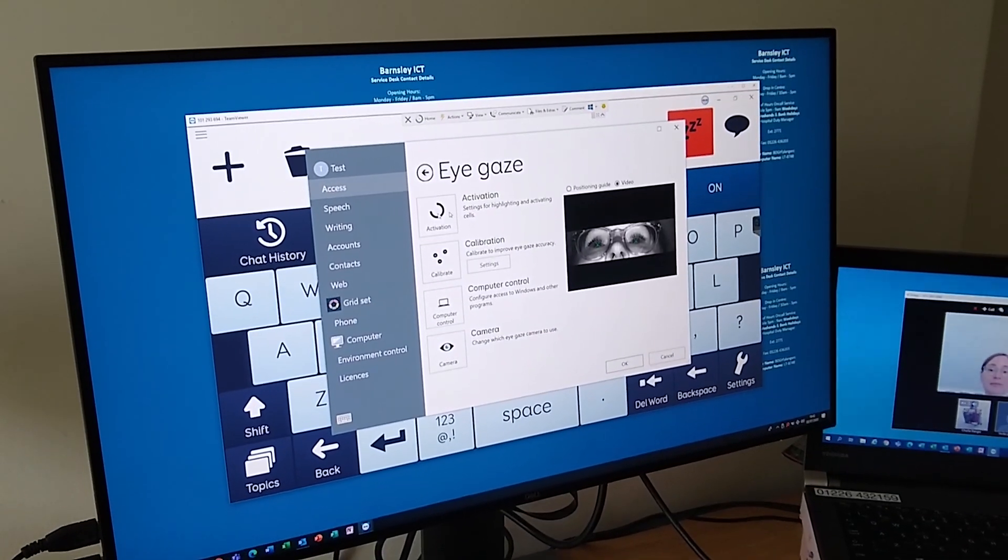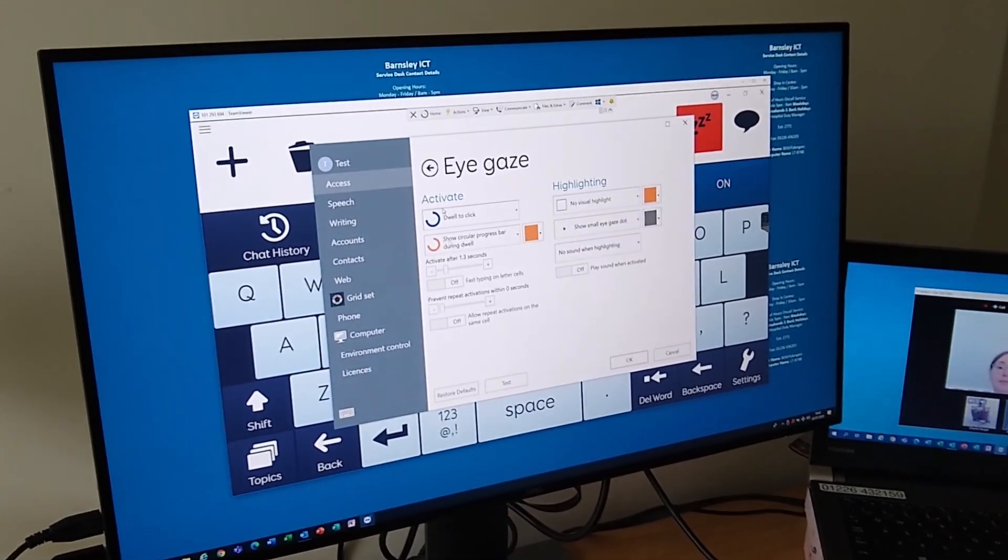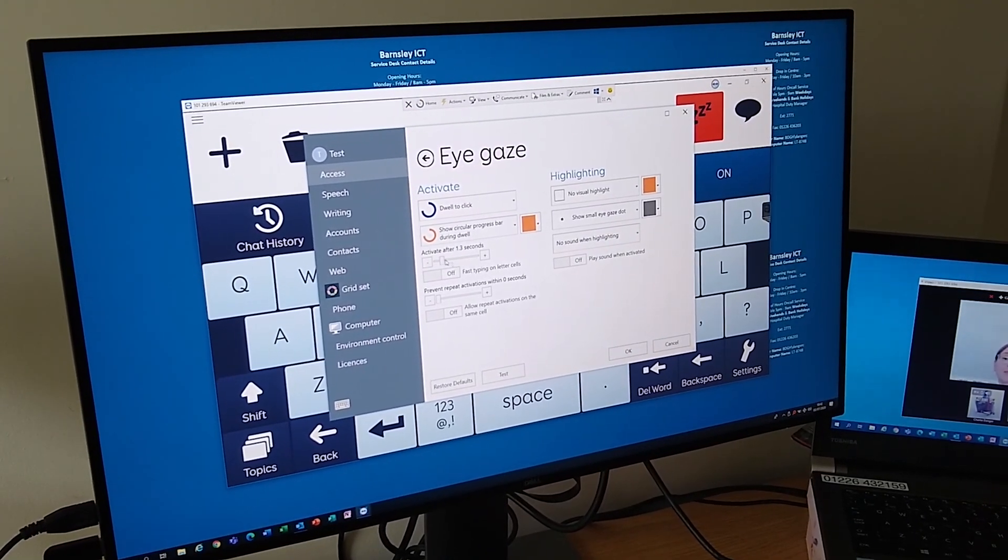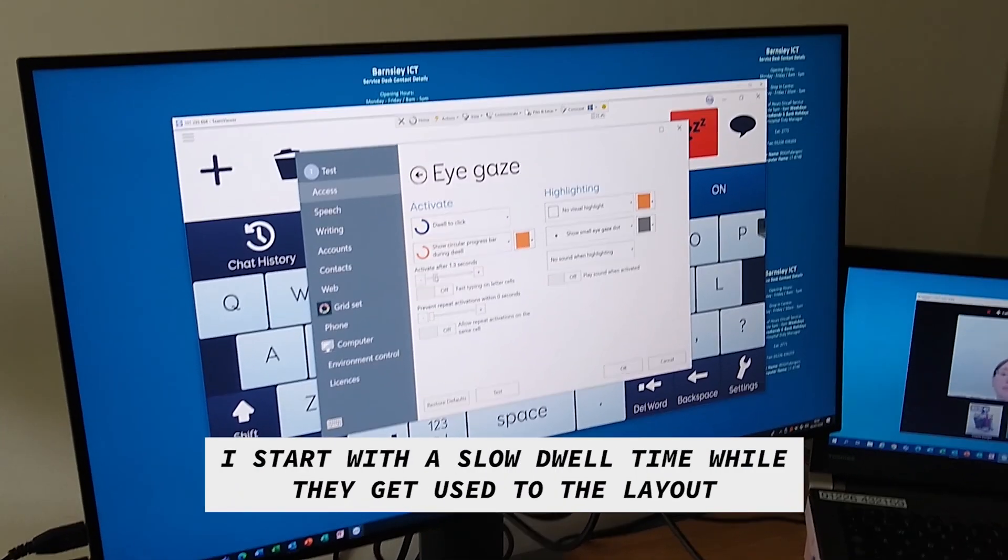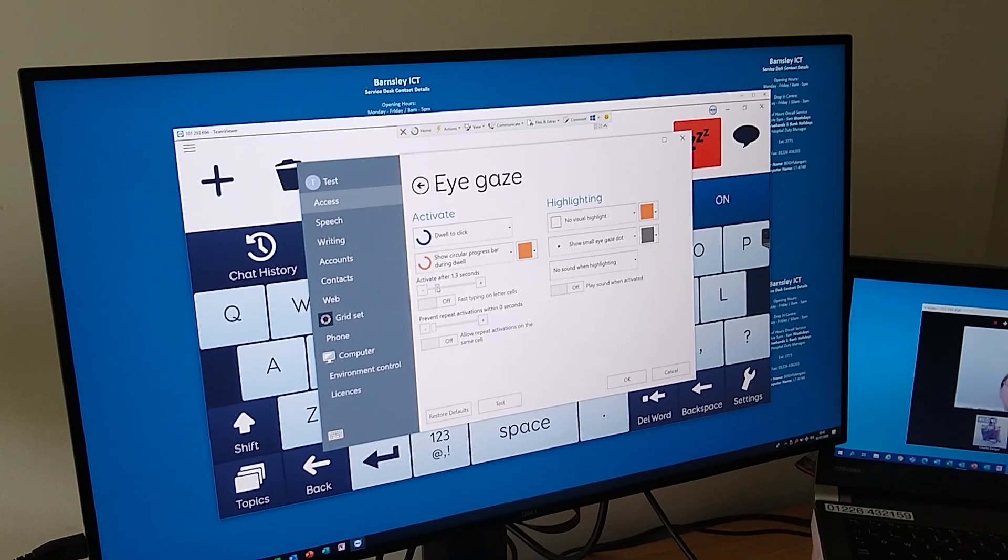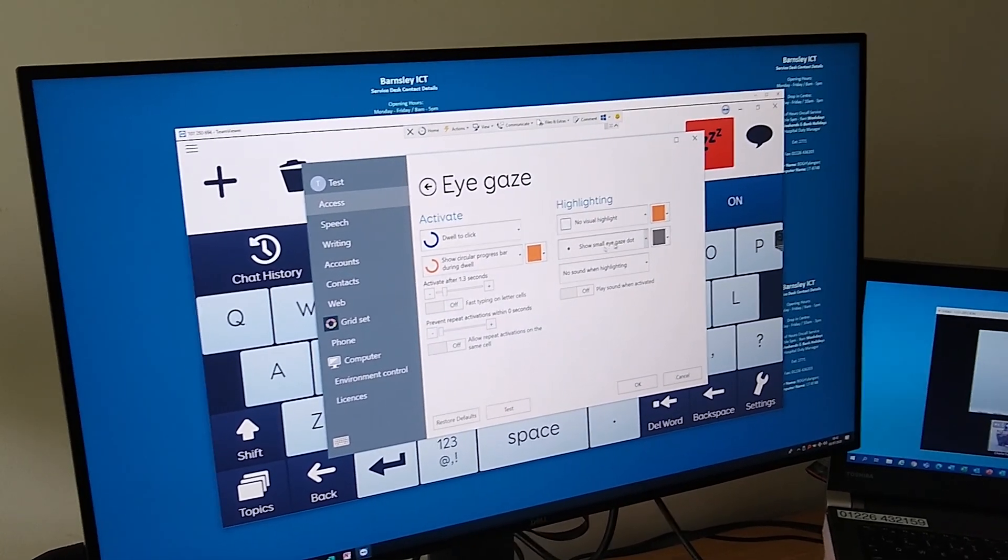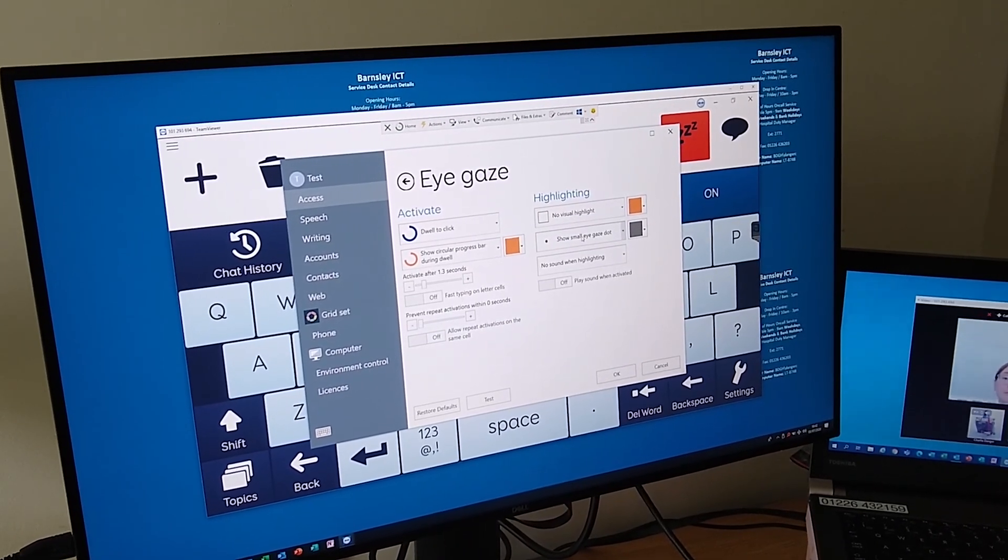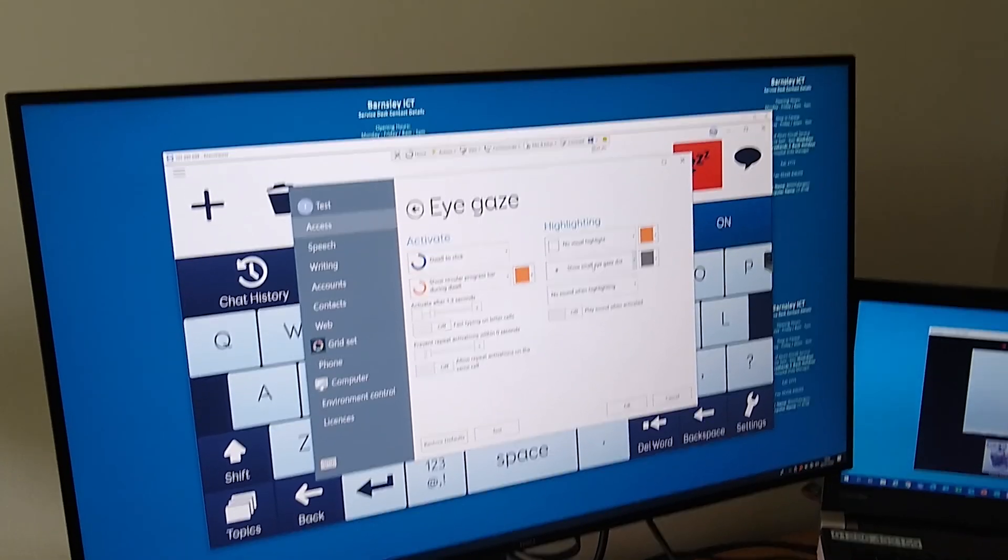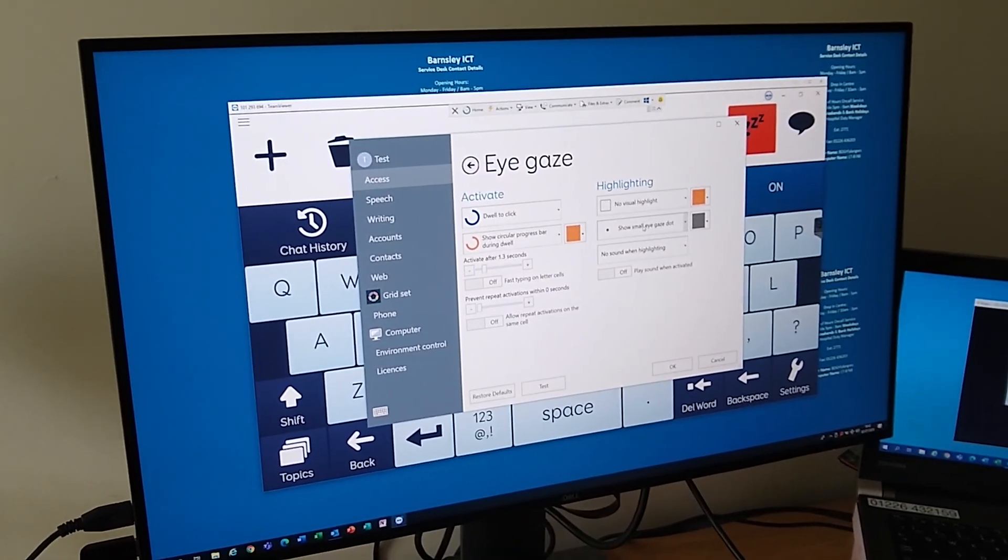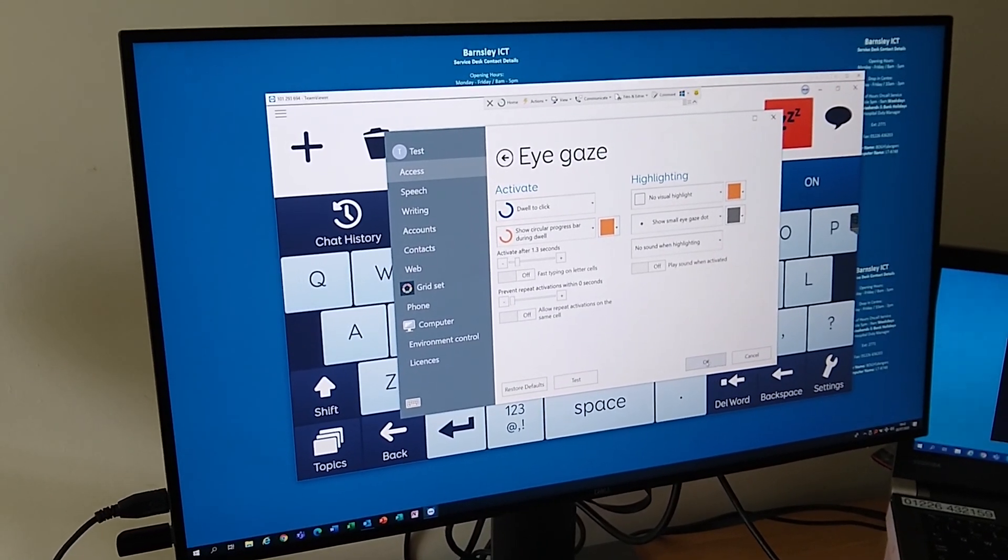Based on your calibration, I'm going to set the dwell time here to 1.3 seconds, so each button that you look at, each letter, will take 1.3 seconds to activate. I'm also going to put on a little dot that will follow around the screen. The little dot might be a bit annoying for you, Alison, but it's to help me see where you're looking, or at least where the computer thinks you're looking, because some parts of the screen may be more accurate than others. Before we do any typing, we'll just check that accuracy using the dot.